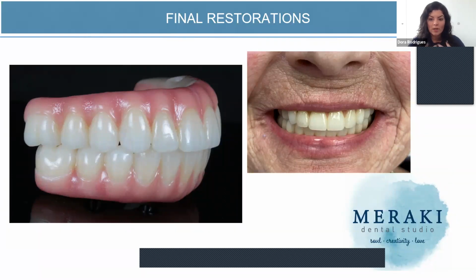I don't do zirconia. I actually work with Sarah from Meraki Dental Studio. She's amazing, and this is some of her work. I never offered ceramic before because I don't do it. I always specialize in chairside assistance and PMMAs, hybrids. And now I'm a lot more comfortable offering zirconia because I can control the design. We can do the try-ins, the prototypes, and then I can just send it to her, and she copies exactly the design that the patient loved, and everything works wonderfully.